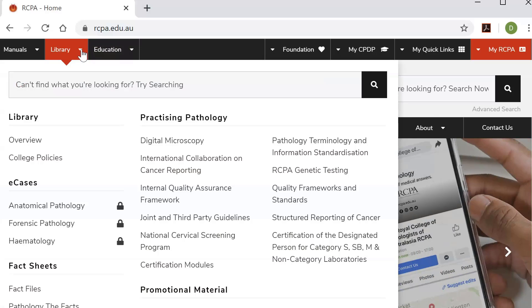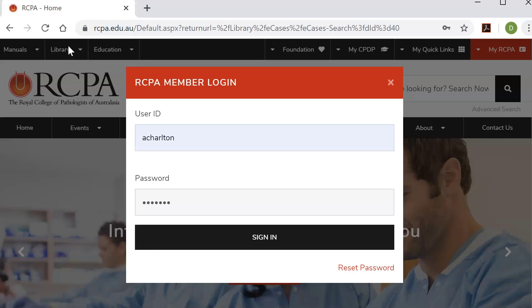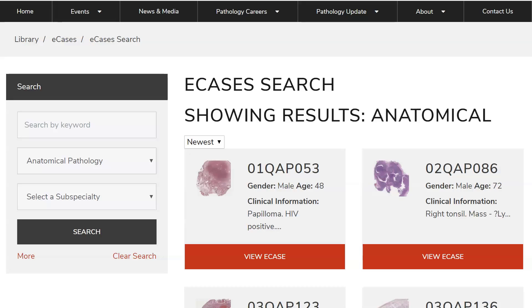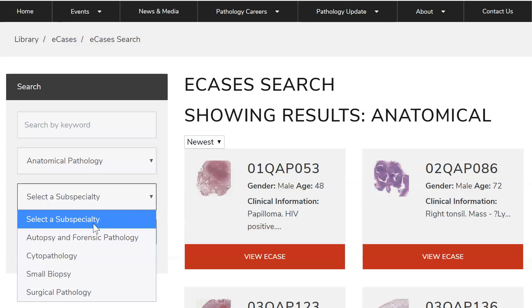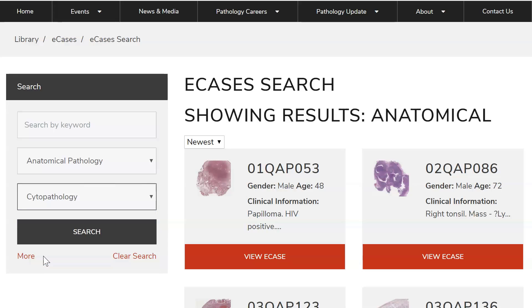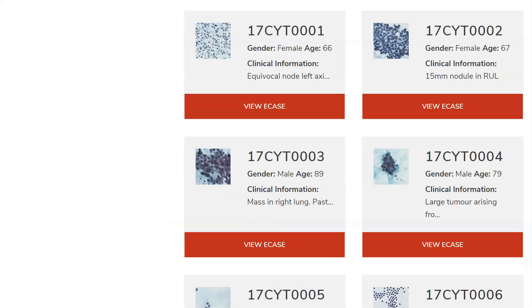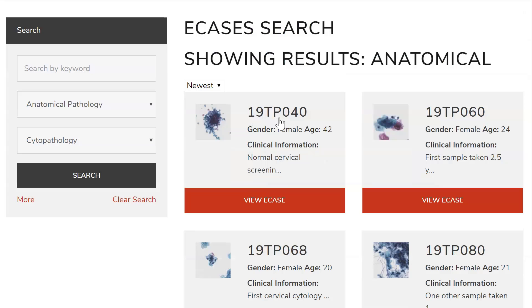Go to Library, then E-Cases, then Anatomical Pathology. You have to log in. There are over a thousand e-cases here. We need to select Cytopathology and search the sector. Cytology cases have the accession number including CYT or TP, meaning thin prep.